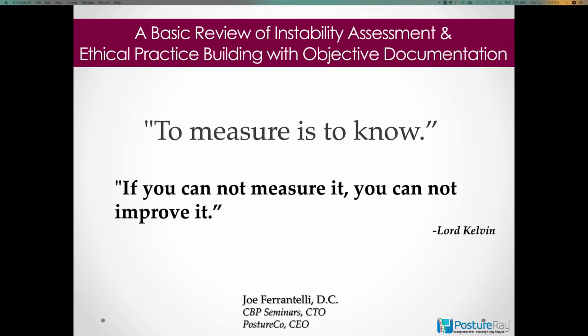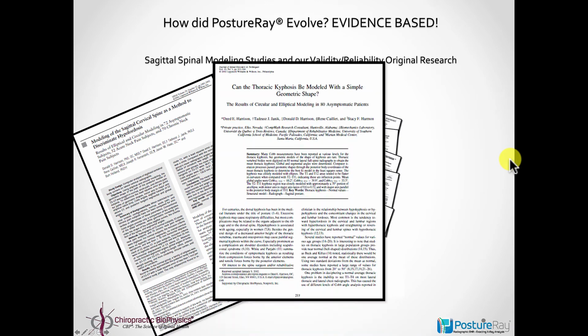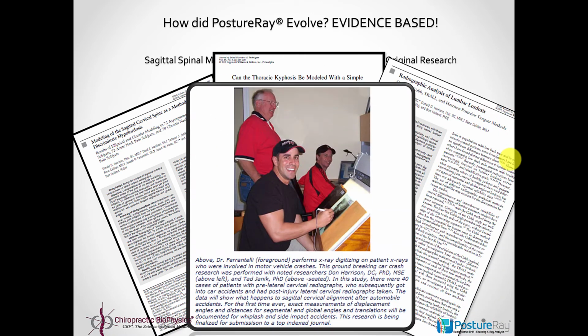Now, I'm going to go ahead and address some of those things, but I wanted you to know as we move forward. So basically, we all know if you're using PostureRay, you want to measure everything. So this slide is pretty self-explanatory. And many of you probably do not know how PostureRay came about.